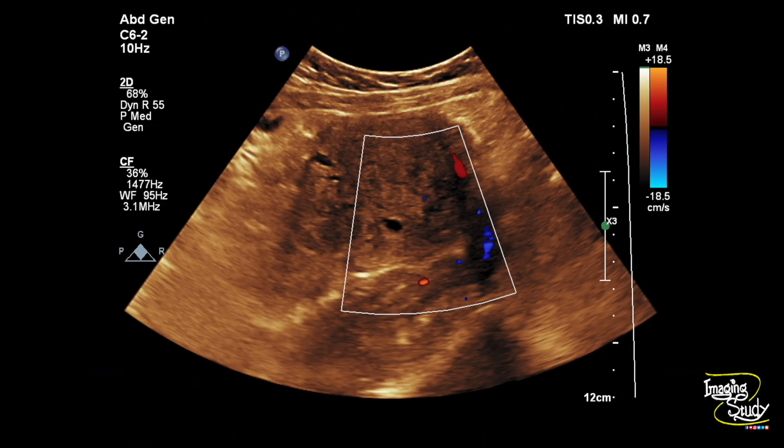Here's the color Doppler picture. You can see the area of adenomyosis shows no abnormal intralesional vascularity.